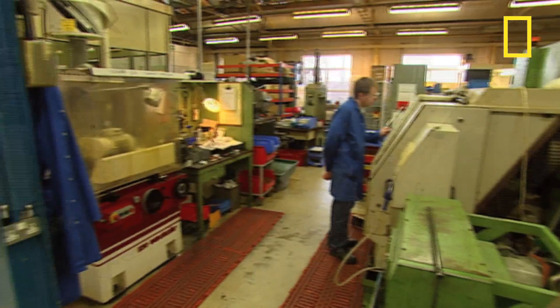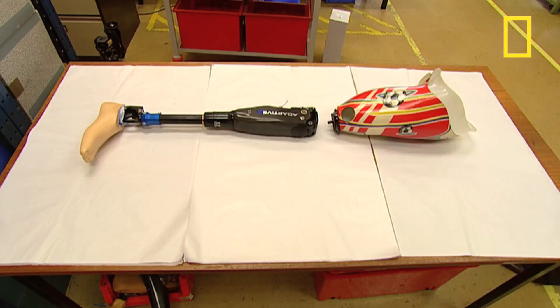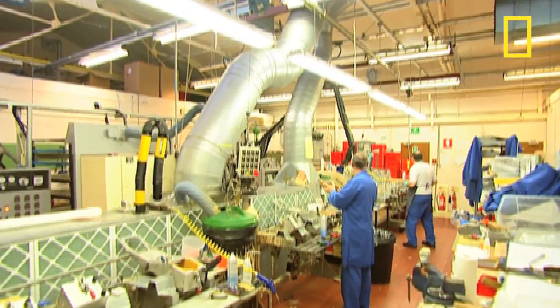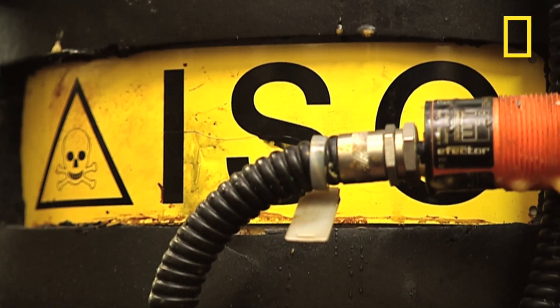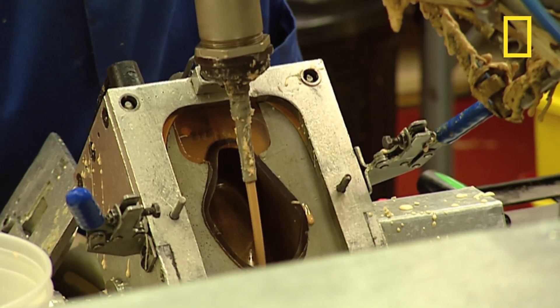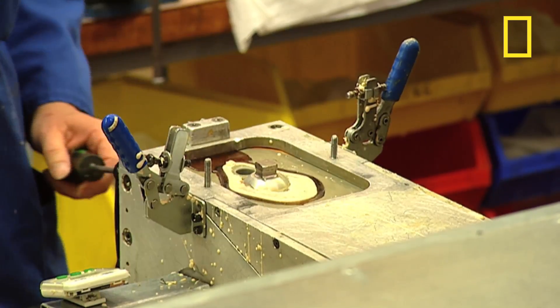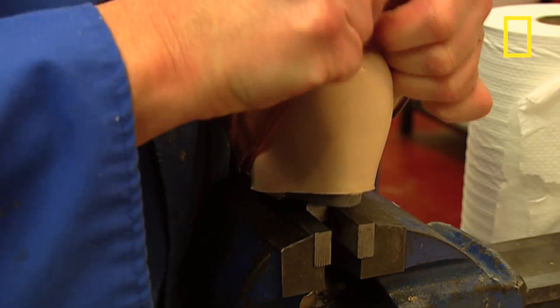This is how a company in Basingstoke, Hampshire makes prosthetic legs. They start at the bottom. The chemicals isocyanate and polyol are mixed together to make a rubber compound which is injected into a mould. One minute later, a hard foot appears. Nine different sizes are available.